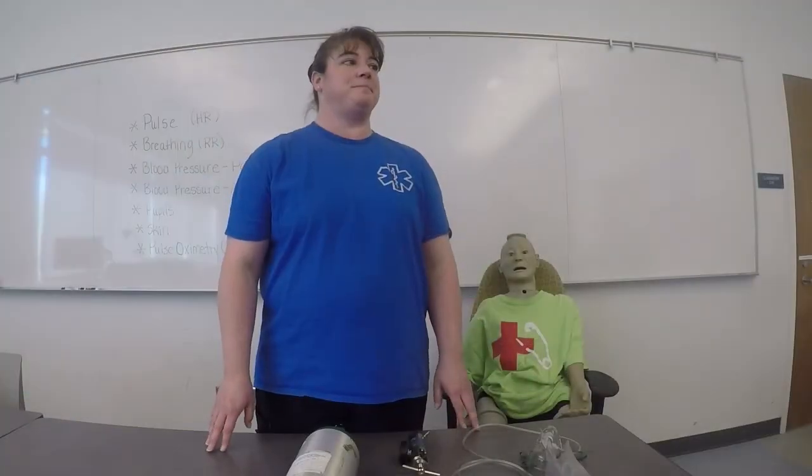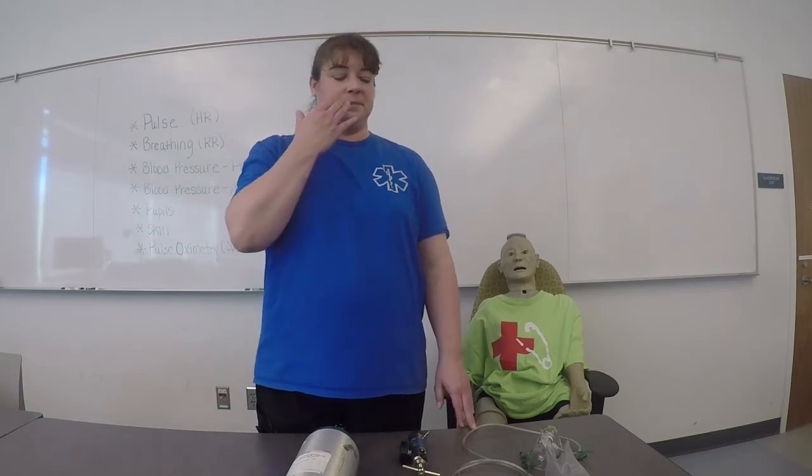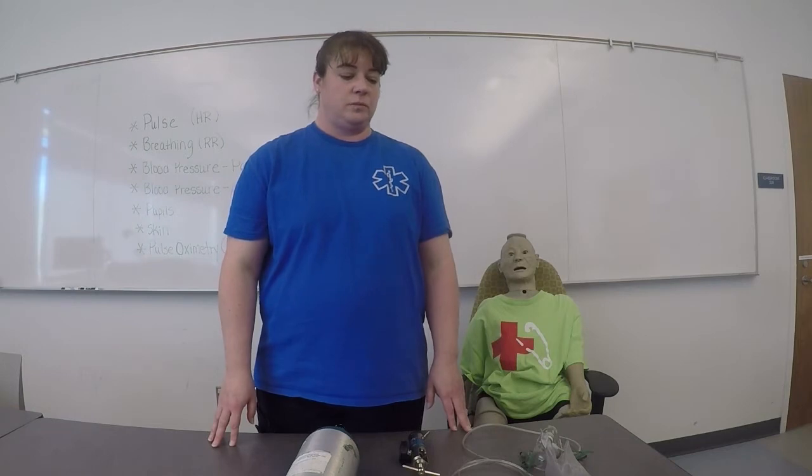I'm prepared. A 45-year-old male is short of breath. His lips are cyanotic and he is confused. You have five minutes to administer oxygen by non-rebreather mask. My scene is safe and I have taken proper PPE precautions.